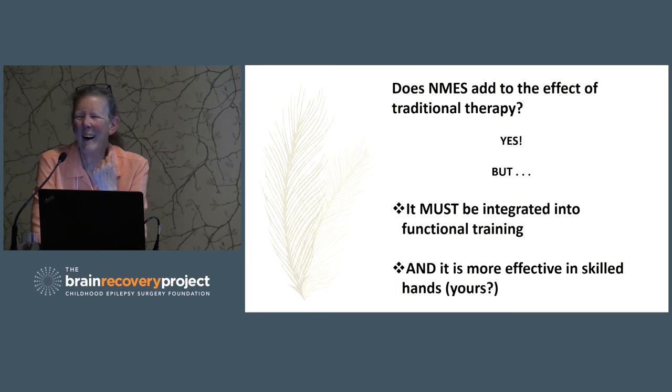Yeah, it is. It's computerized. It's definitely not controlled by anybody but a computer. Robotics are great, computers are great, as long as they're working for you and you're not working for them. So you've got to be careful about that. I've had times when I've had the engineers come in and help us set up a 9-channel stimulator. But it's a want-to-see, can-it-be-done, is-it-possible sort of thing. I try to pare it down as quickly as I can into 2 or 3 channels.